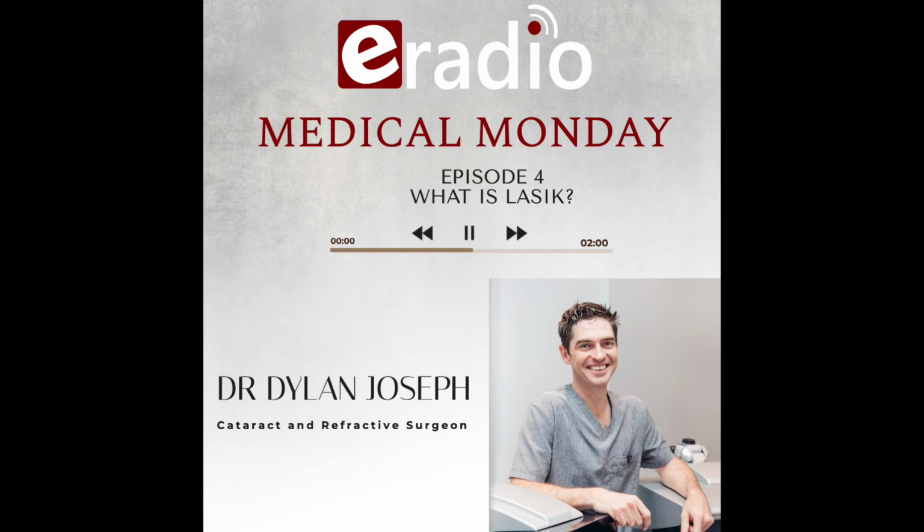And we've got very, very capable and excellent support in South Africa. The technicians that service our lasers are internationally trained. They look after us. The lasers are exceptionally intricate and need to be serviced at least twice a year. And we've actually got something called log files. So we download log files after all the procedures. We send those to the technicians, and they go through those with a fine-tooth comb. So if there's anything that comes up that needs to be addressed before something happens, then they're on it and they sort that out.